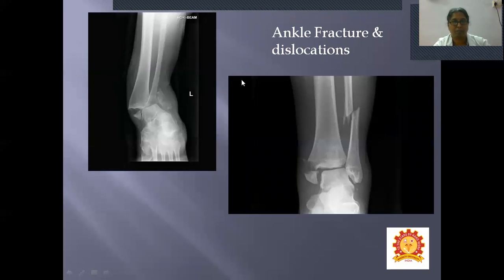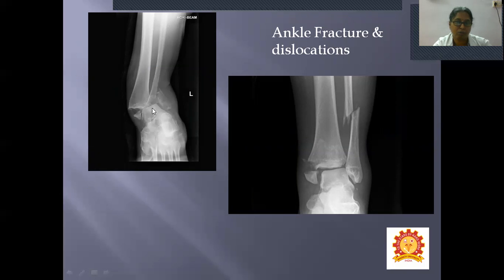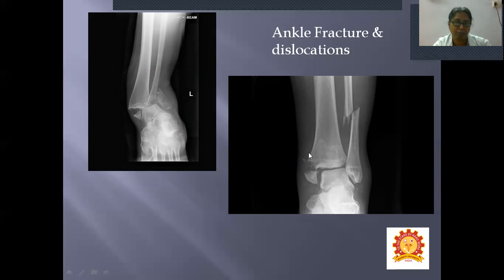Ankle fractures and associated dislocations are also visible. For example, the lower end of the tibia broken with tarsal bones also fractured, or fracture of the medial malleolus combined with fracture of the shaft of the fibula.